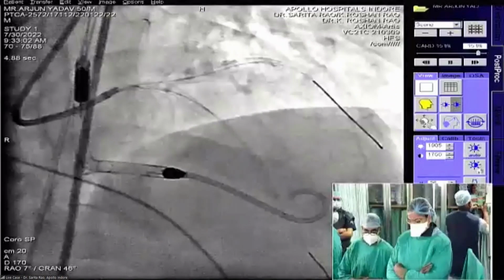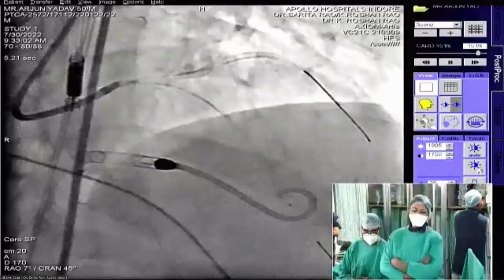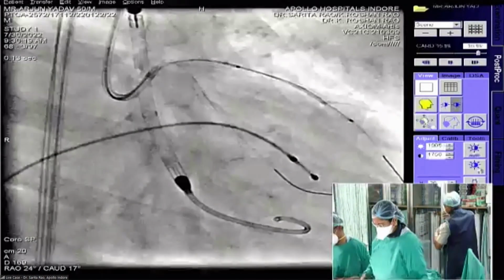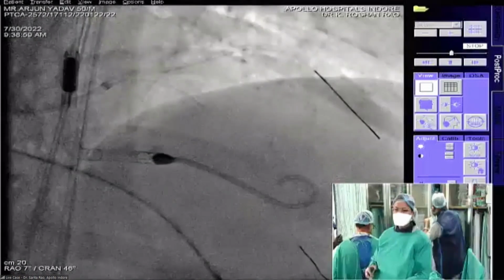Right. But a word of caution generally is that the LCX ostium is a difficult animal to conquer. Once you do something, the patient tends to come back. So do it only if you feel it is absolutely essential. Here we did OCT, and if you are seeing some struts across, then maybe a small low pressure inflation to separate the struts, you can do it. But don't be too aggressive. So I make a final decision with the provisional.